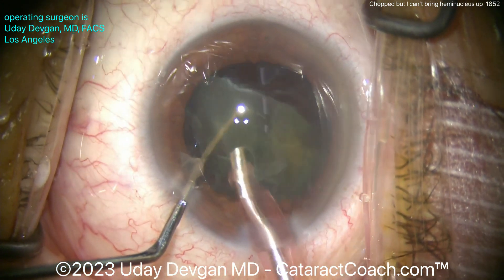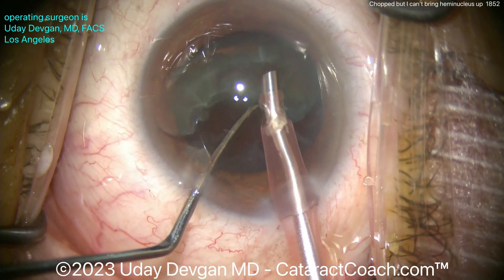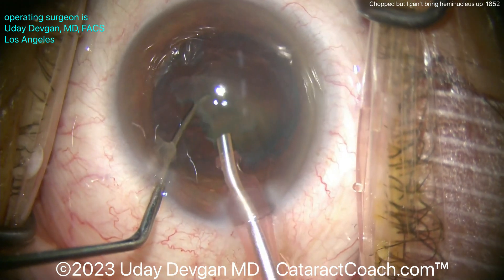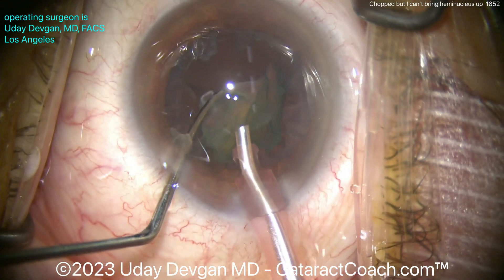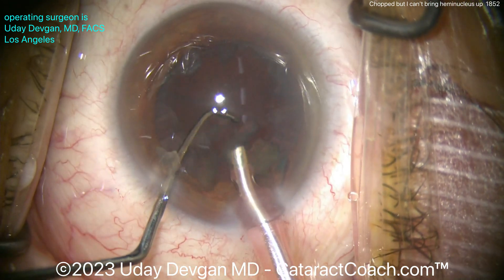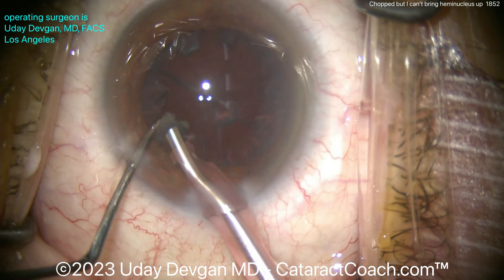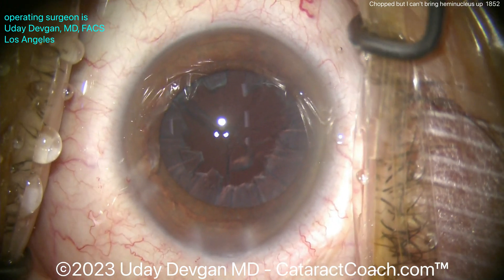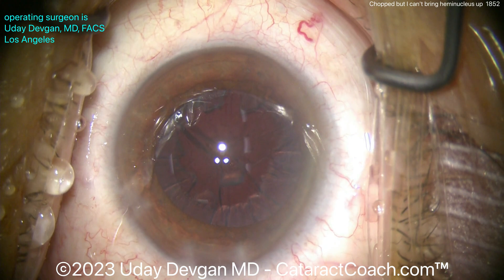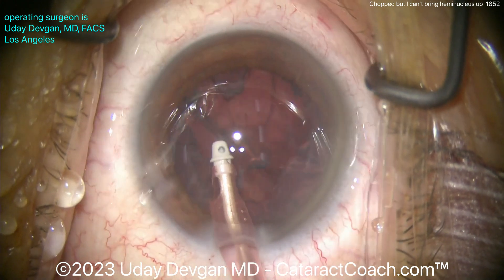Keep this in mind: if you're chopping a nucleus and you've got pieces — either two halves or four quadrants — and you just can't bring them up, oftentimes the issue is not your phaco parameters, because you've already been using those all day and they work just fine. It's typically that the pieces aren't fully separated, the chops weren't fully propagated, and you don't have distinct nuclear halves — like in this case. That's why it was so difficult for me to bring it up. Once I bring them up, the rest of the case is pretty easy.